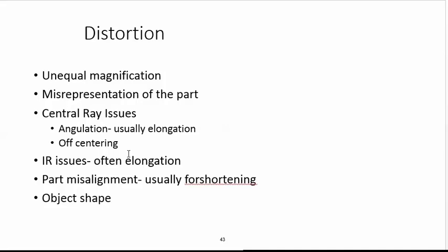And again, get an image receptor, go in a room in clinicals, take some x-rays of some things and angle the central ray, and you can see how this works. Structures that have a natural increase in OID are going to be greatly affected by distortion of central ray angulations. That's why the Towne's looks the way it does, because the head is almost spherical in shape. So you've got a natural increase in OID.